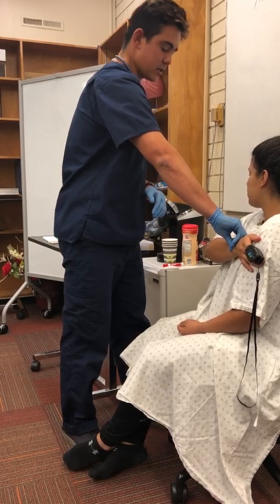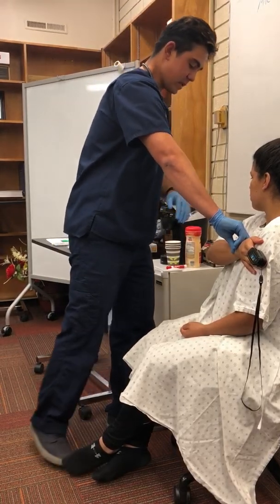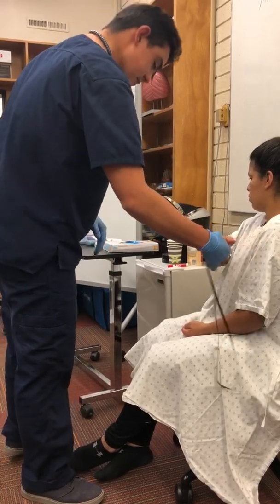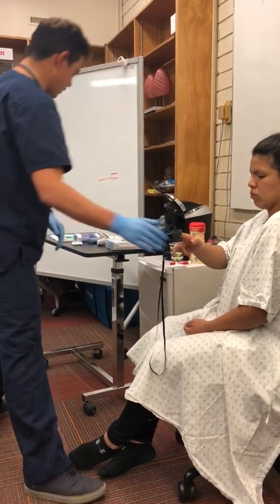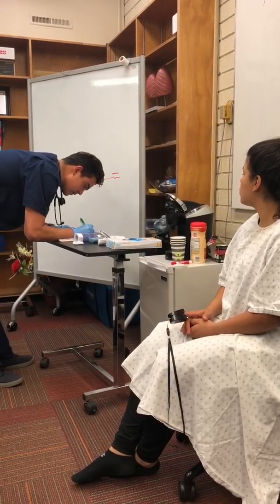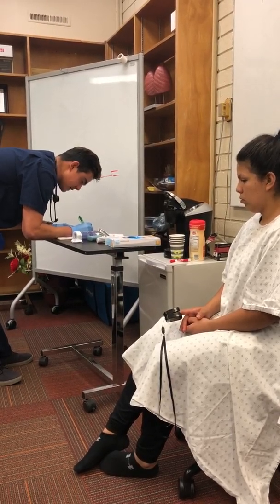Okay, so we're going to do 30 seconds of pulse and 30 seconds of respiration, and not inform the patient so that they don't alter it consciously. So we are at 8 respirations and a pulse of 30. Okay, thank you very much. I'm going to go ahead and check this. We're at 98% as well. I'm going to leave that on you for just a second while I write this down. Heart rate of 30, so 60 heart rate when multiplied by 2, as well as 16 respirations a minute.